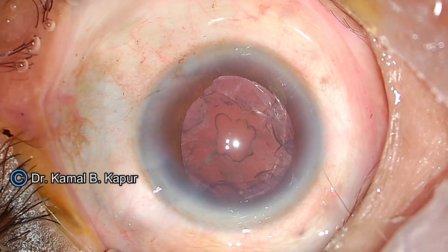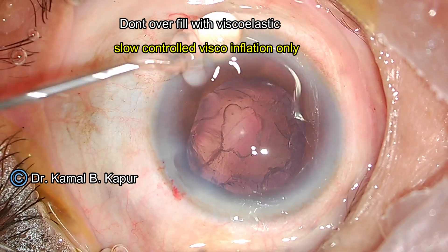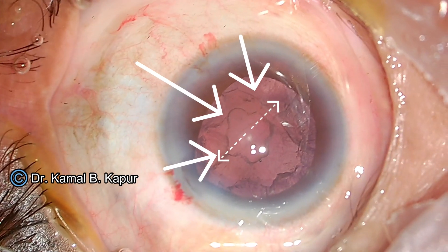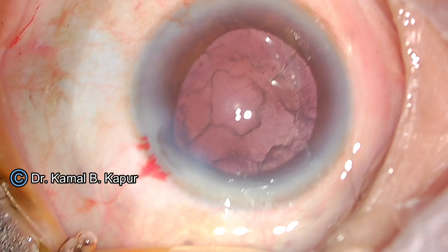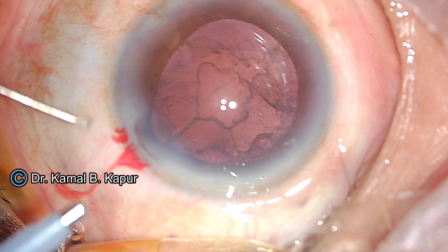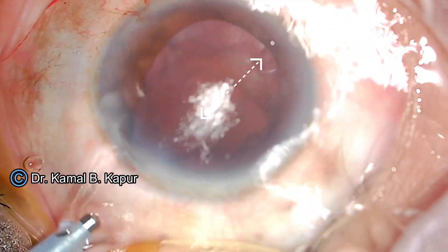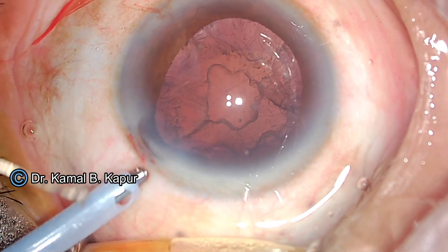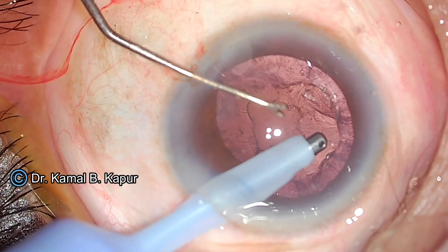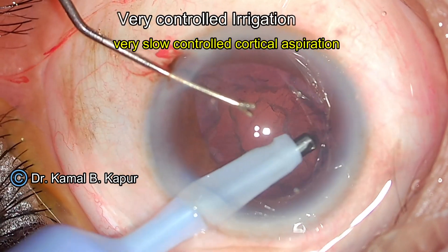Before we withdraw our irrigating instrument, we ensure that we put viscoelastic but never over-pressurize the anterior chamber. A slight amount of viscoelastic is instilled. The case is re-evaluated and you can see a complete linear posterior capsular opening. We confirm there is no vitreous loss. We do a controlled irrigation-aspiration of the remaining cortical part under a very moderate bottle height of 100, vacuum of 430. We make sure there are no air bubbles before starting irrigation, as this can lead to extension of the posterior capsular opening and cause vitreous loss.